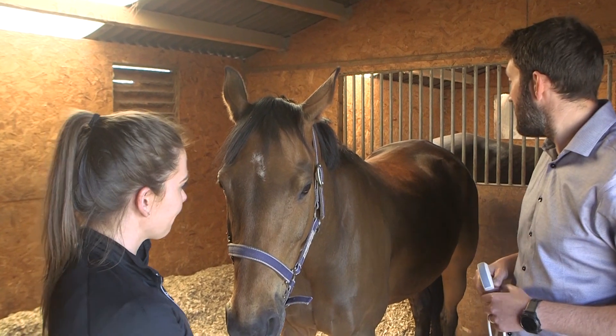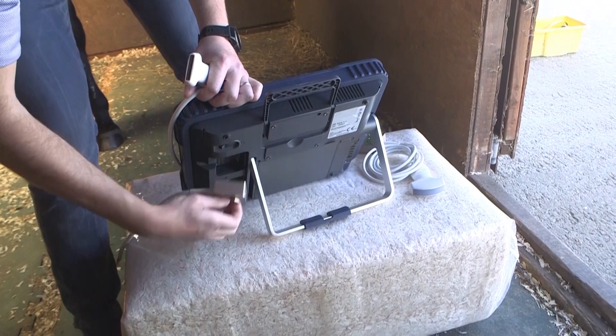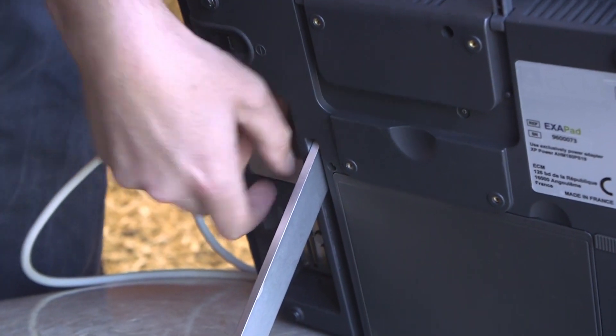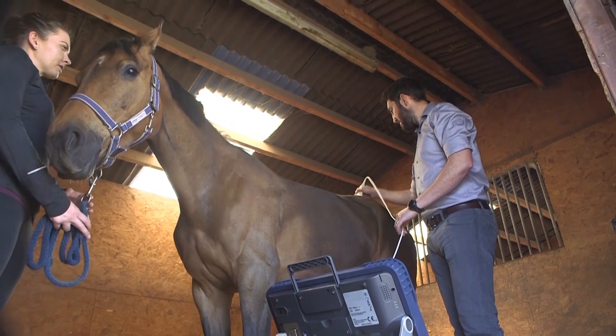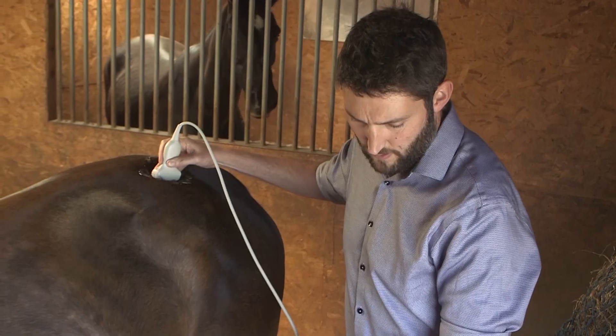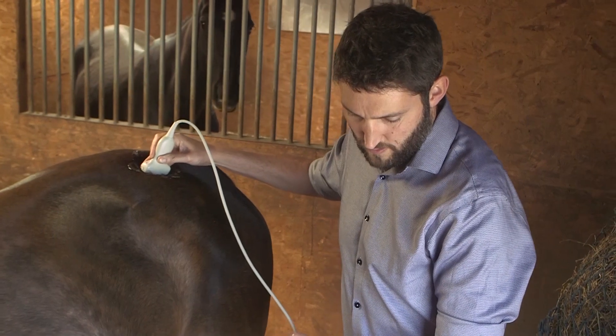Be ready for the unexpected with a range of interchangeable probes. Move from abdominal and musculoskeletal scanning through to the cervical spine, choosing your preferred probe. The Exapad ensures the very best in image quality, no matter what you are scanning.